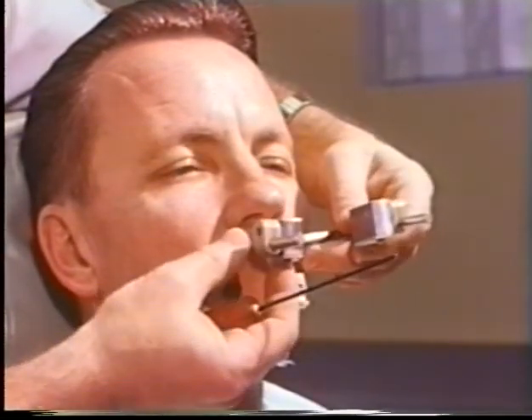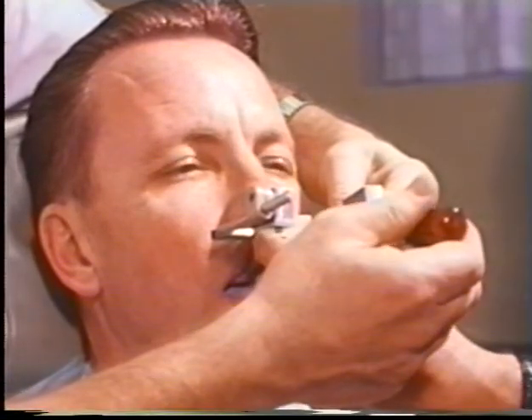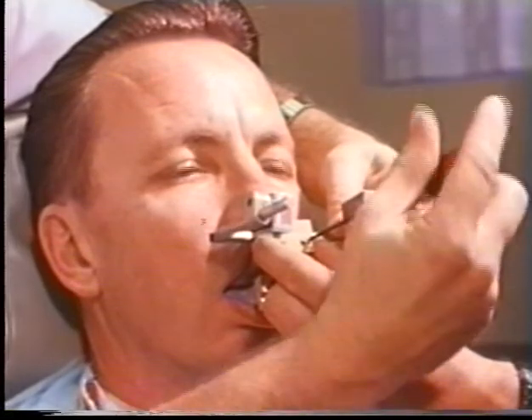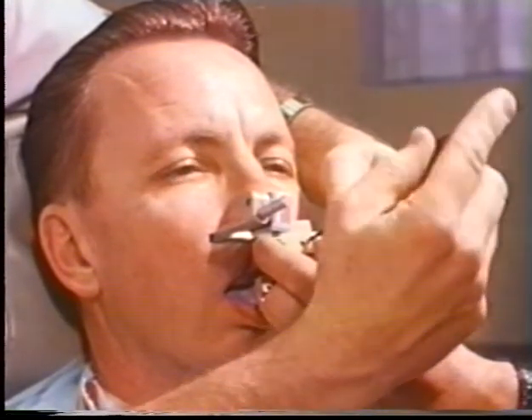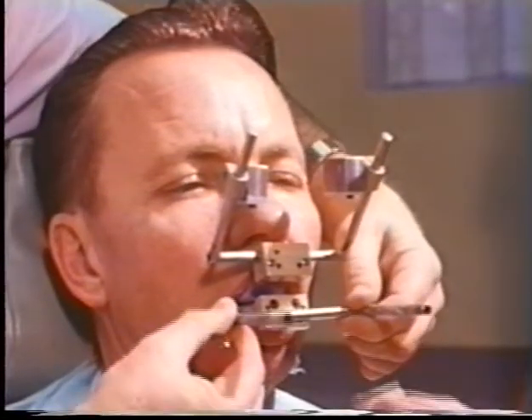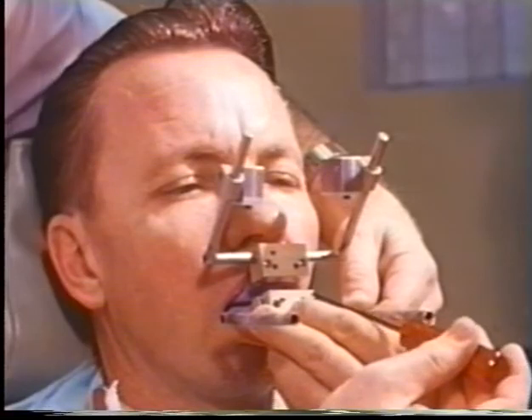A U-shaped frame is attached to the maxillary clutch to hold the upper recording bow. Note the two attachment cups on the frame. A similar U-shaped frame is joined to the mandibular clutch to attach the lower recording bow.